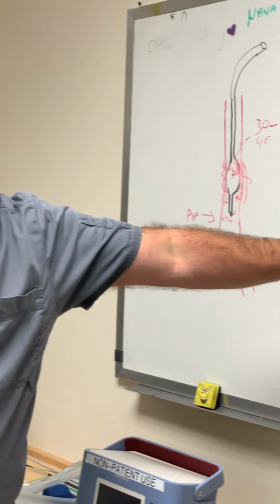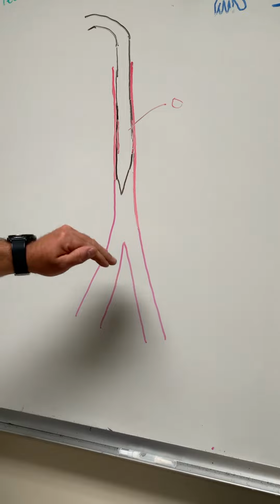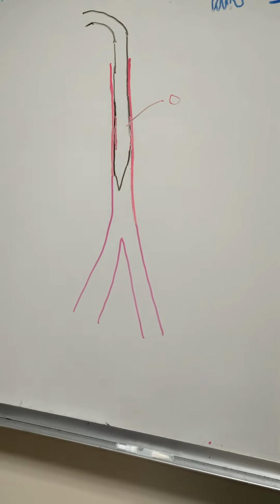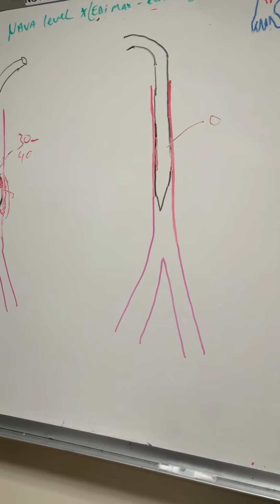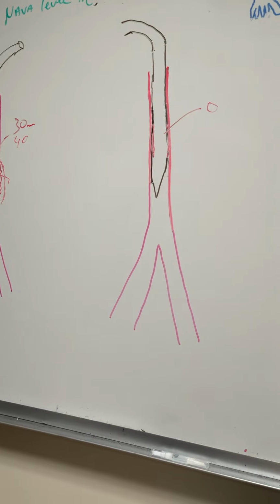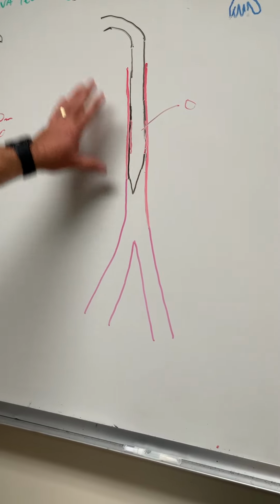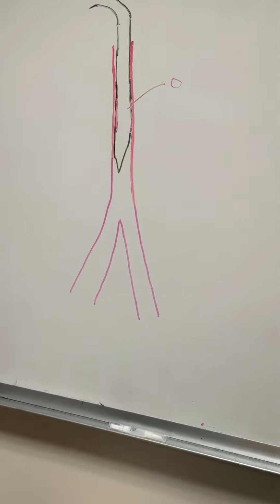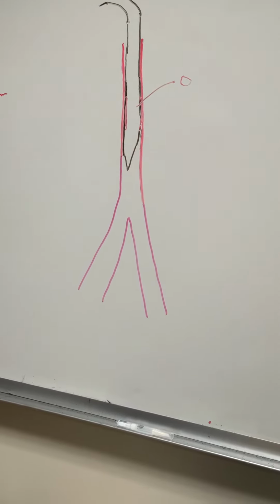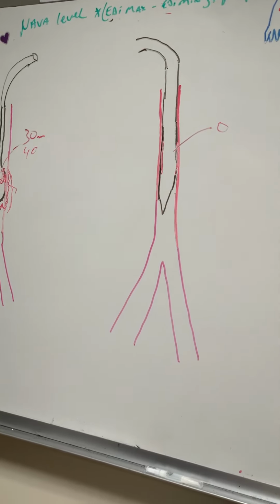Here comes the leak test that we're going to do. We're going to manage this with the cuff staying deflated because there's no leak, and that's our cuff practice of minimal occlusion. But we need to know what leak is occurring, because if this kid's leak is actually occurring at, say, a PIP of 18 or 16, anything less than 20 centimeters of water pressure, the odds are favorable that when we pull this tube out, the trachea has not been stented to a degree that it's going to rush blood into it and occlude the airway, right? The odds are that that's not going to occur. It can still occur, but it's less likely if the leak is below 20 centimeters of water pressure.